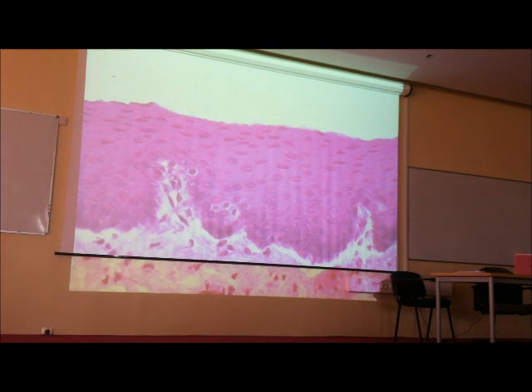What is about this type of epithelium? Is it much better than yours or not? So I will get very clear slides with no doubt. All of you will know.